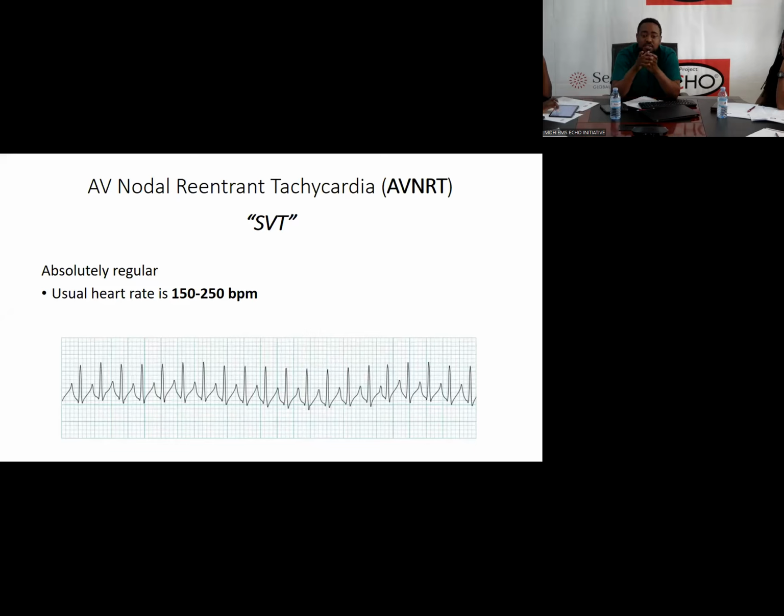When that happens, we see a rhythm similar to this one below. It's quite common, so each time you're evaluating a patient and you see such a rhythm, think of an SVT. The next presenter will talk about how this could be managed at the bedside and how referrals can be made in case your interventions are not helping.